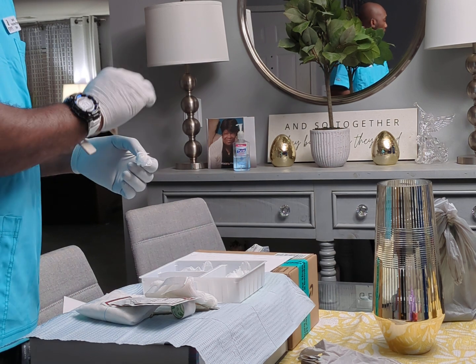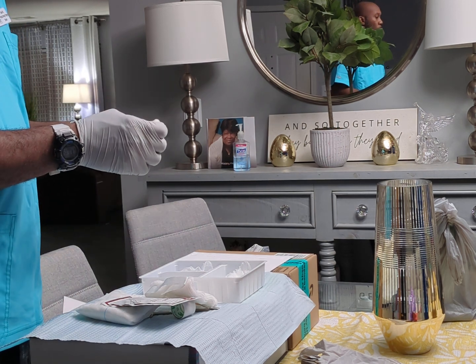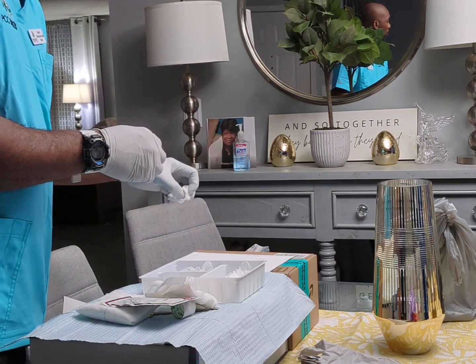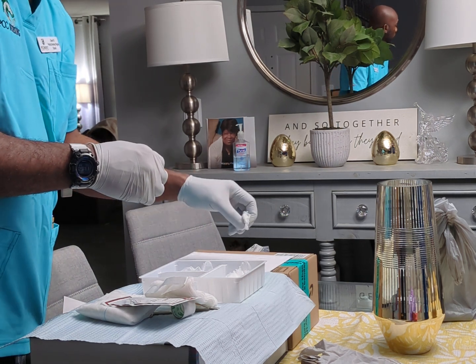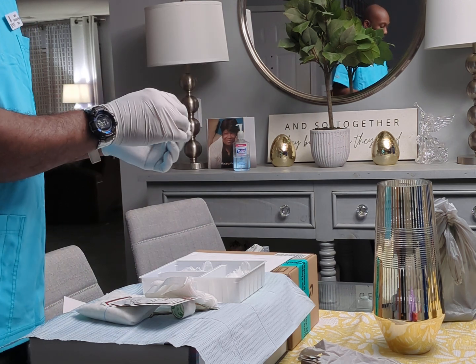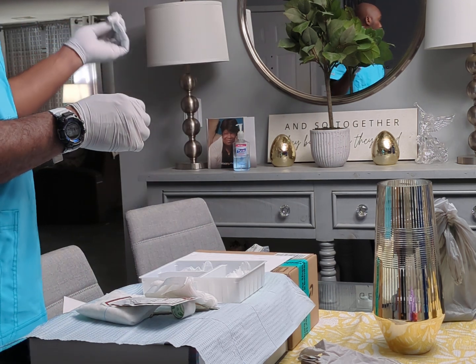All right, so now we're going to clean the outside of the wound. Same thing, another gauze, and we can use two sides of that gauze. We're going to go from top to bottom of the wound on one side, then top to bottom on the other side, flipping the gauze, making sure we use the clean sides. Once we finish with that, we toss that gauze.